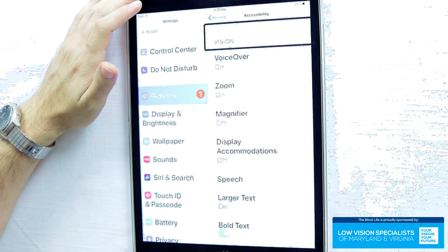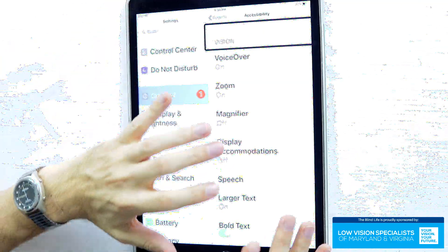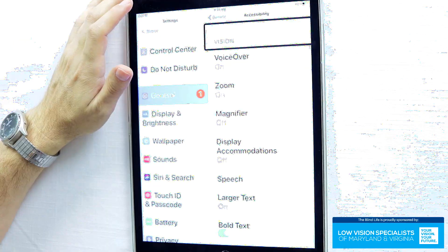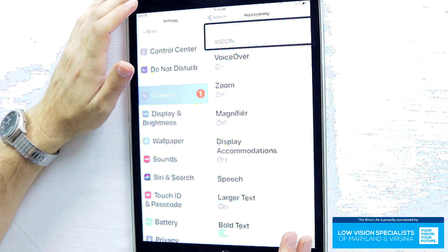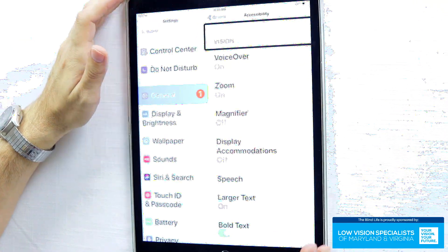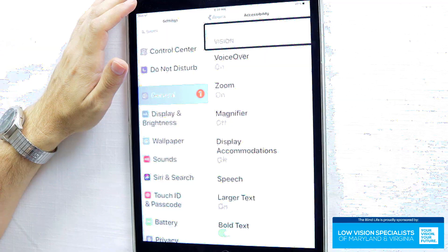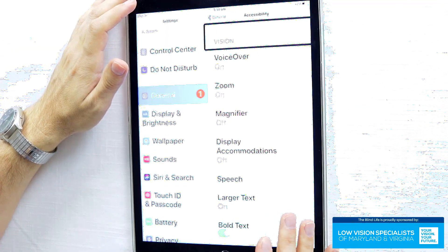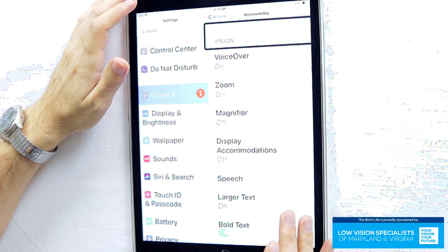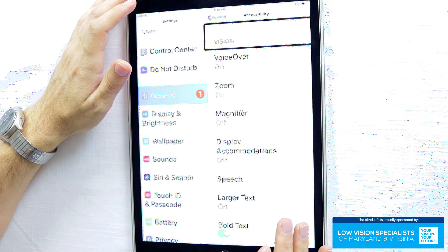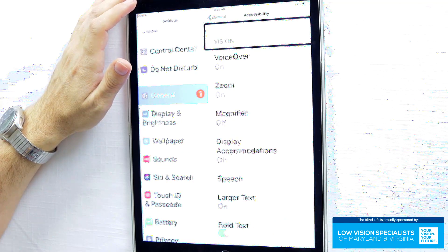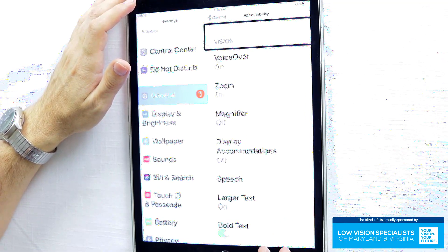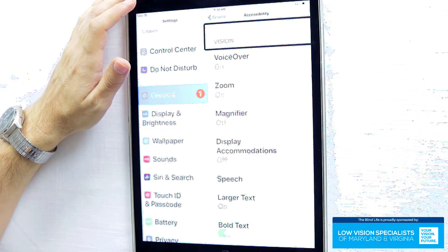The final thing I like to do is go in and change the voice for VoiceOver and Siri. When you get your device for the first time, it's going to be the older robotic voice. Go in there and choose the enhanced voice — it's much more natural sounding, it has inflection, it doesn't sound so robotic.